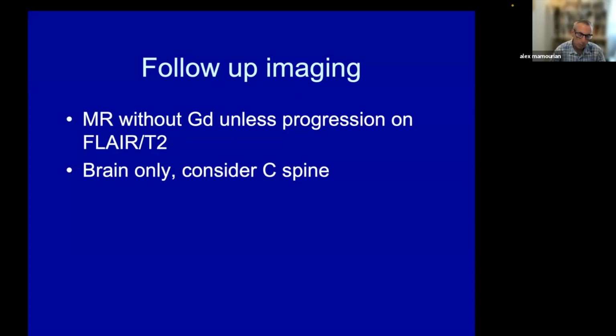And important to recognize that clinical follow-up is, of course, important, but measuring things like increasing fatigue or other neurologic findings can be difficult because of some expected variation from day to day. So the follow-up imaging with MR is critical for the clinicians making decisions about the patient's medication.